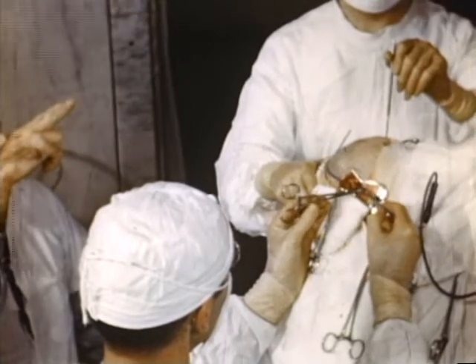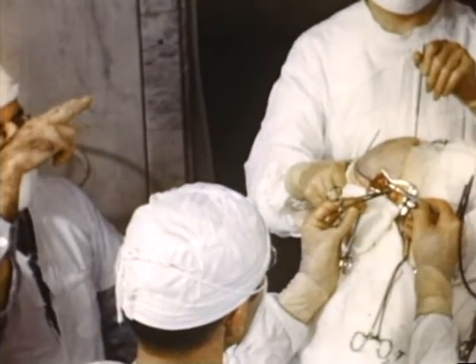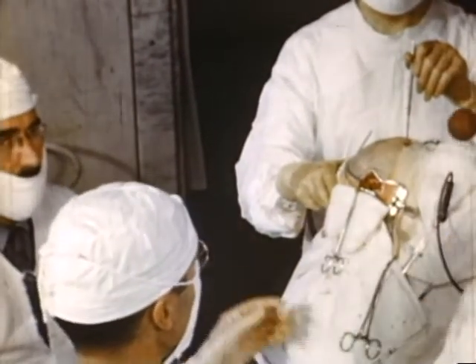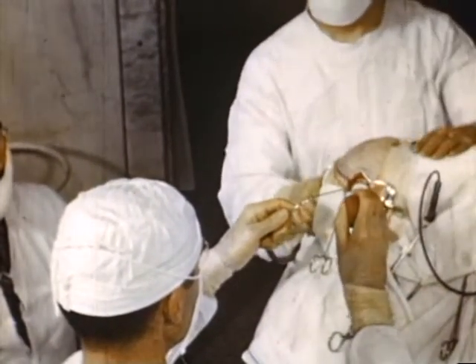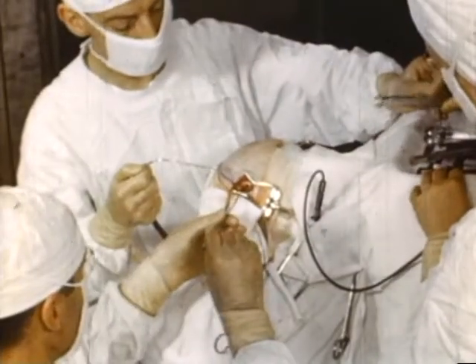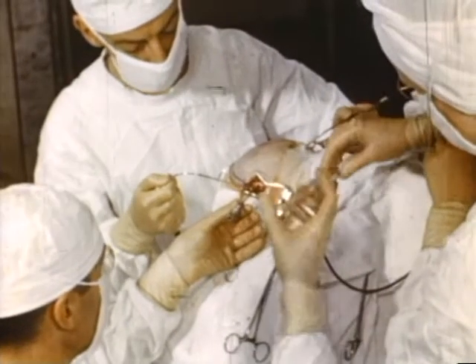Still guided by the neurologist, the surgeon cuts the upper quadrant in the same way, always maintaining the instrument in the plane of the coronal suture, as indicated by the guiding neurologist. It seems to be of little importance whether or not the ventricle is entered. The incisions are irrigated out with normal saline in order to control hemorrhage. Usually there is very little bleeding, most of this coming from the superficial cortical vessels.